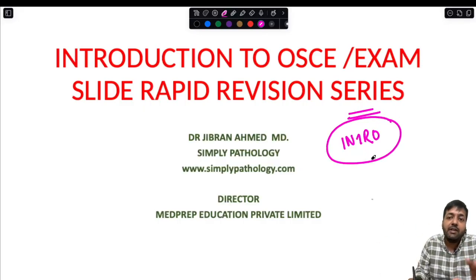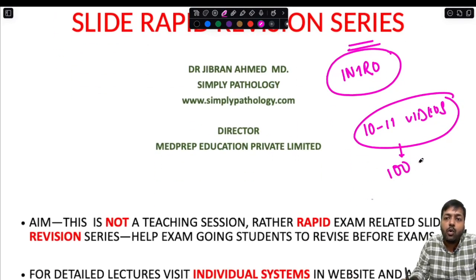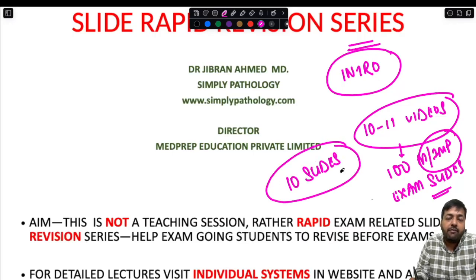This series will be having approximately 10 to 11 videos, okay? And in this series we are going to cover 100 most important or most commonly asked exam slides. So this will be covered. In today's session we are going to see the basic introduction to the series, and we will discuss 10 very important exam slides. So without wasting any time, let us begin.